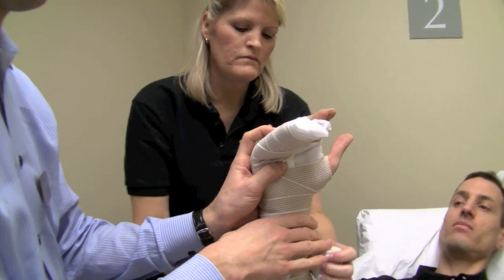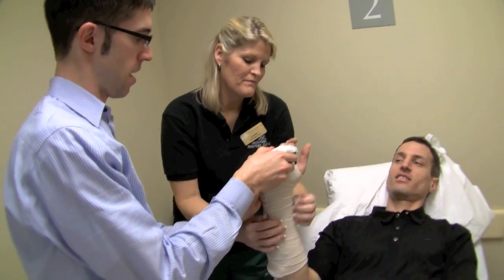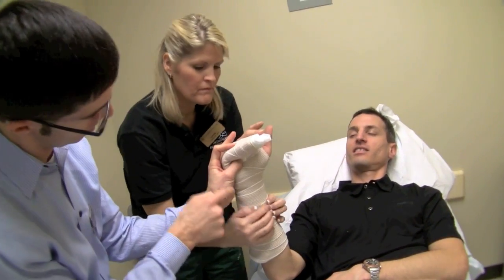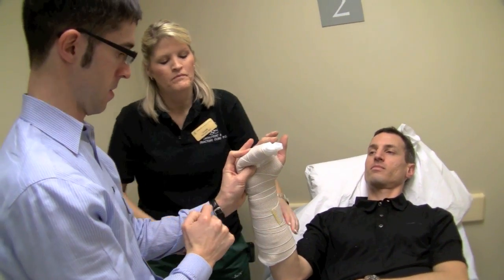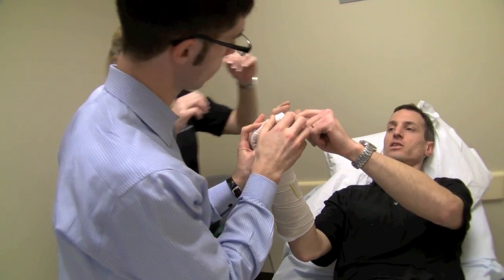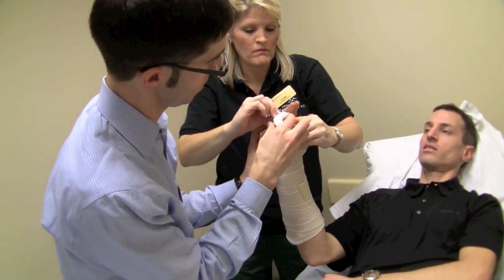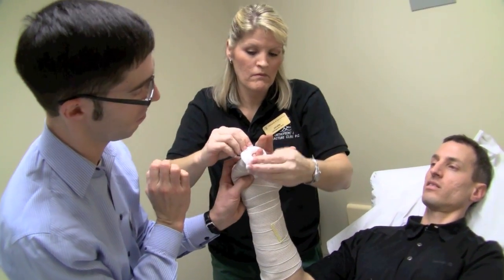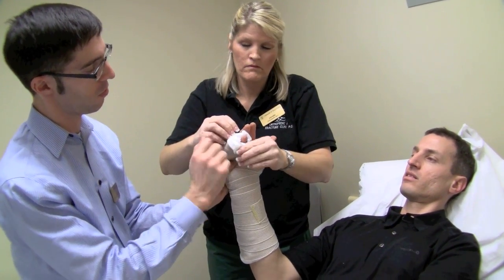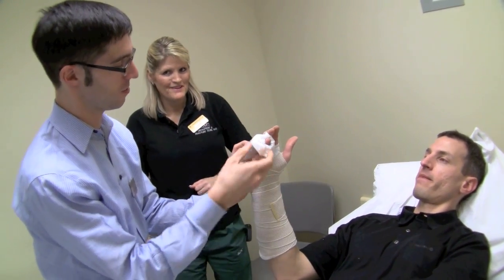What I'm feeling now is everything gently molded, keeping my fingers in that 90-degree flexed position. When you tense your wrist and fingers, relax — and all of a sudden the wrist extends to a more natural position and we can hold your fingers in a better position. You can see a nice bend through there, and we just hold it till it dries. It's nice to be able to see the tip of each finger so you can push in and check the capillary refill. You can fold the stockinette back and get the ace wrap over it to make it look a little cleaner.